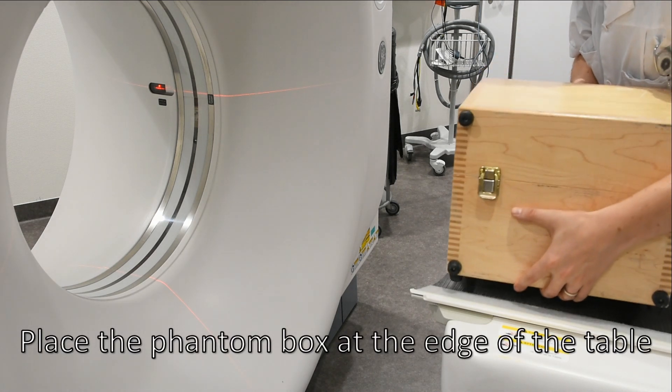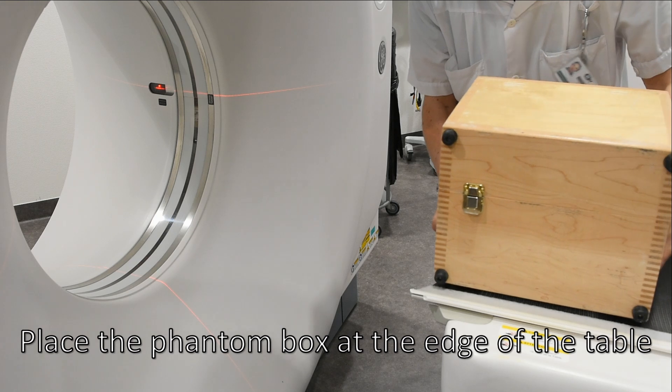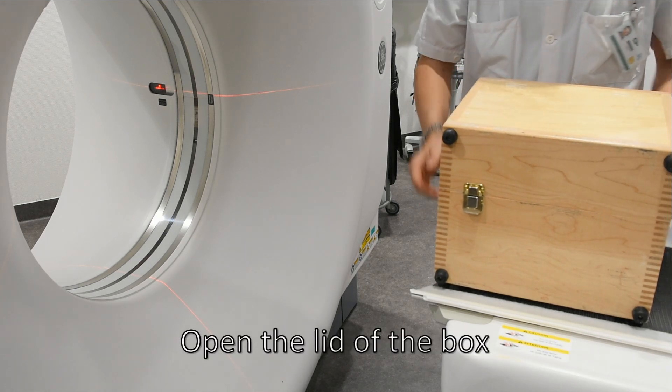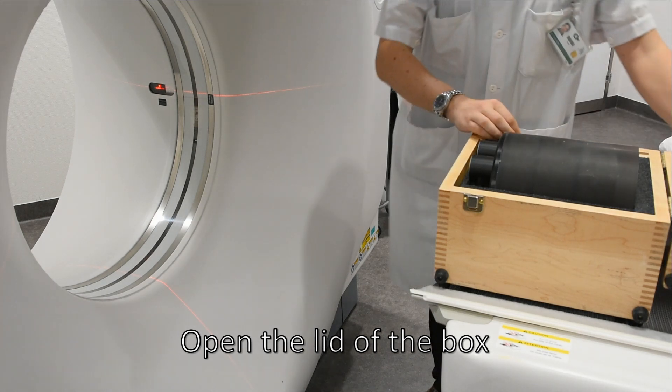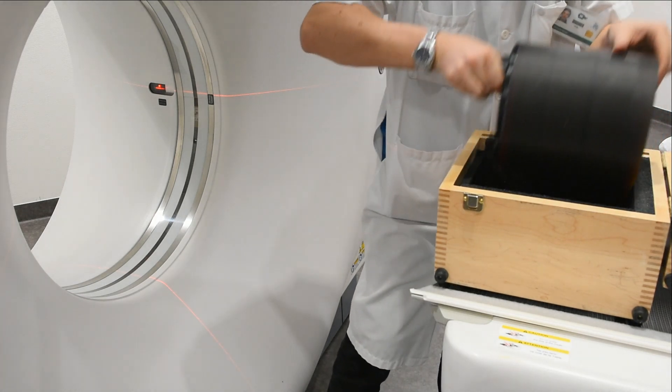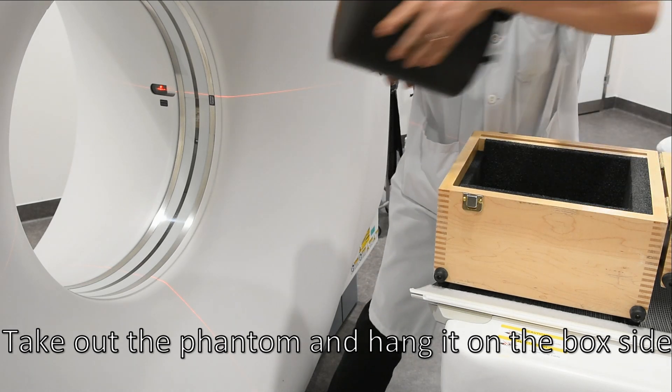Place the phantom box at the edge of the table. Open the lid of the box. Take out the phantom and hang it on the box side.